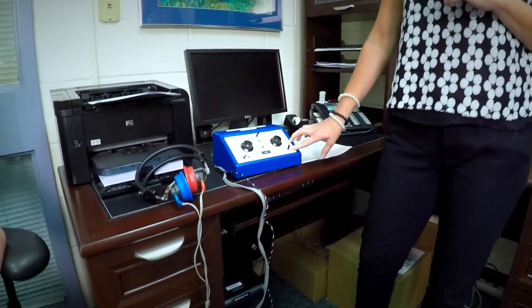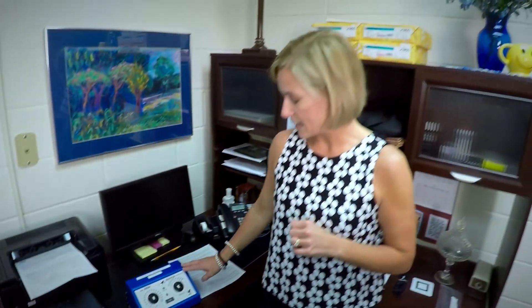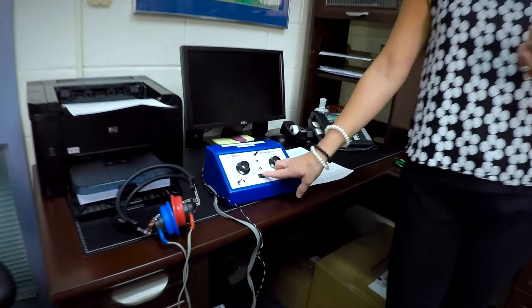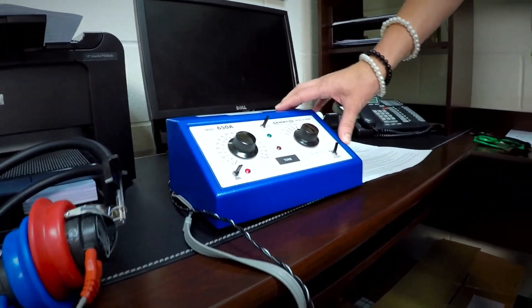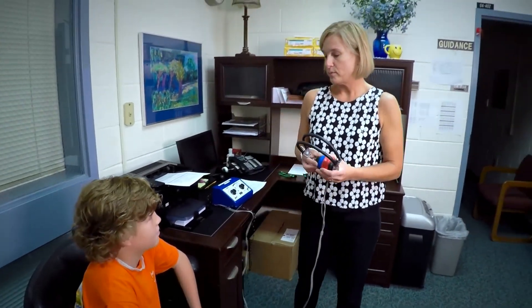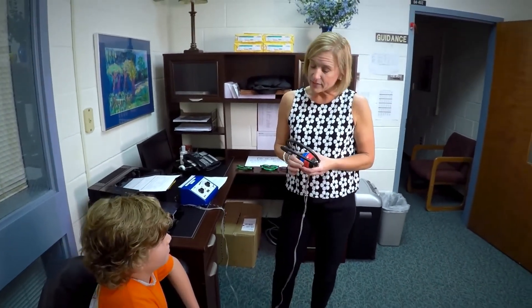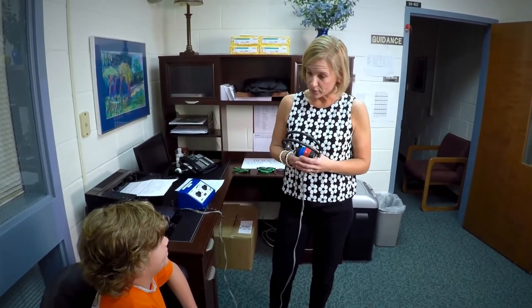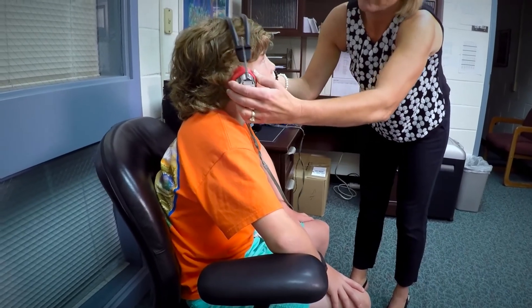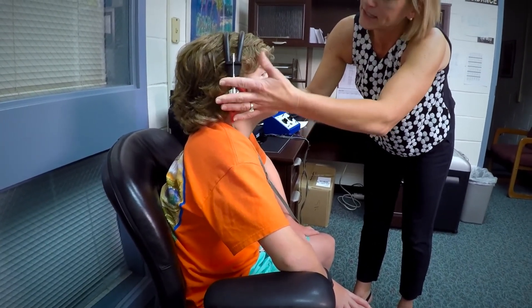You should also have it set on pulse so the student will hear pulses of sound, and they are going to raise their hand when they hear the sound. In order to present the sound, you're going to push the tone button. Explain to the student what they're going to be doing — tell them they're going to hear some little sounds and every time they hear a sound they're going to raise their hand. Put the headphones on with red on the right and blue on the left — red round right — and put that on their ear.